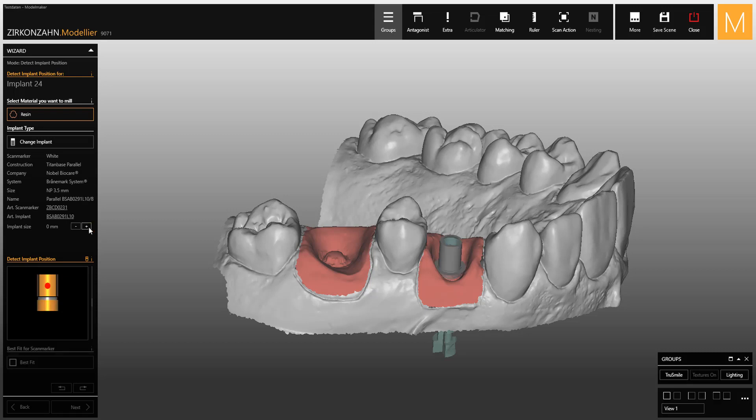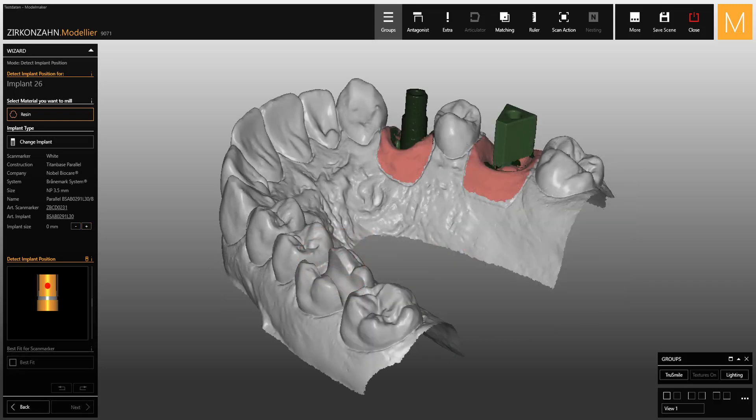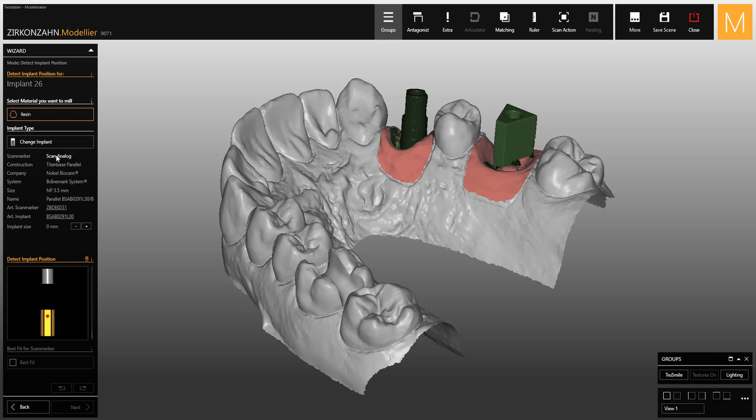click on the minus or plus button placed next to Entry Implant Size in the wizard. Otherwise, if you have selected the wrong scan marker, change it with a left mouse click as shown.